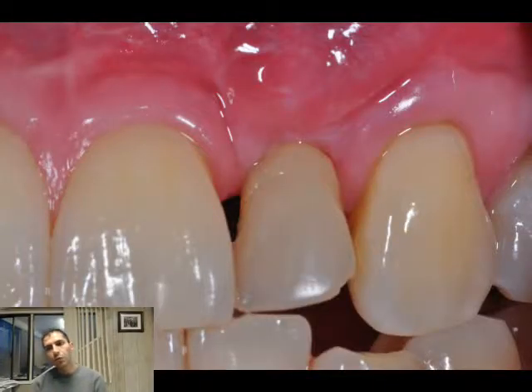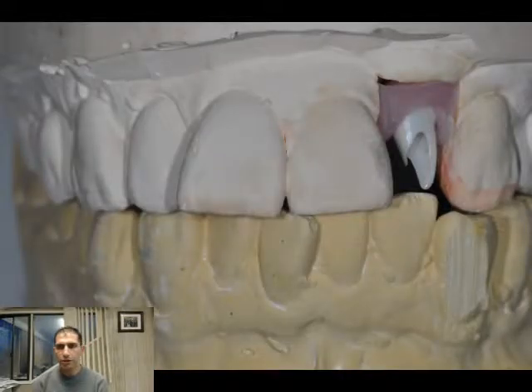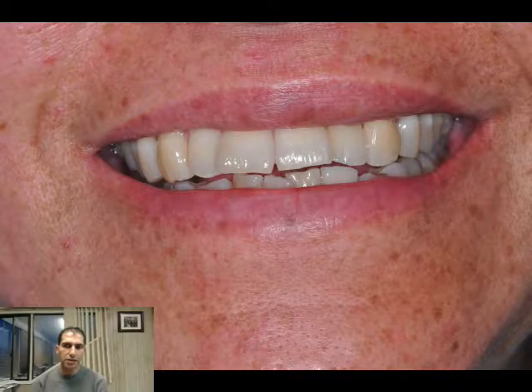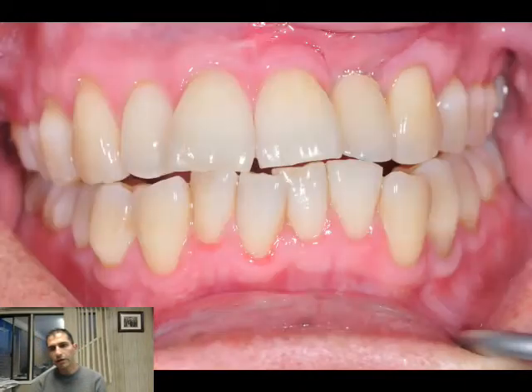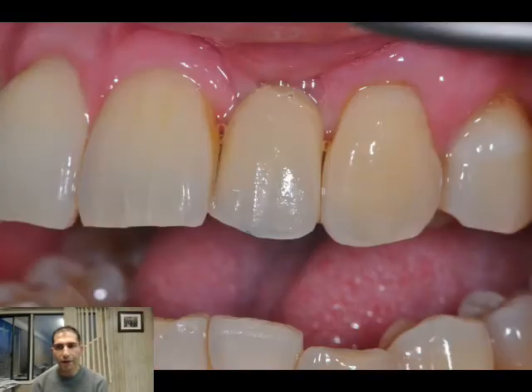We're going to match the porcelain with the enamel and dentin shade. This is the full arch impression. We're going to utilize a full zirconia customized abutment, and this is the porcelain work by our master ceramist. You can appreciate the work our partners in the dental lab can do for us — our master ceramist definitely made me proud. The patient was very happy with the aesthetics.